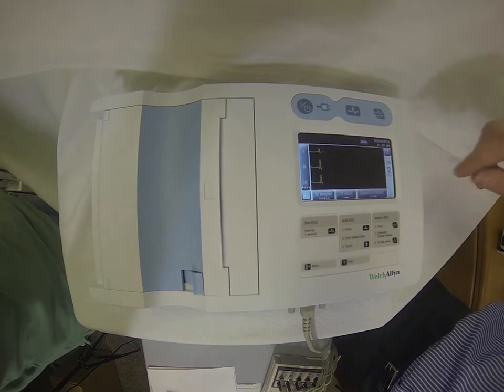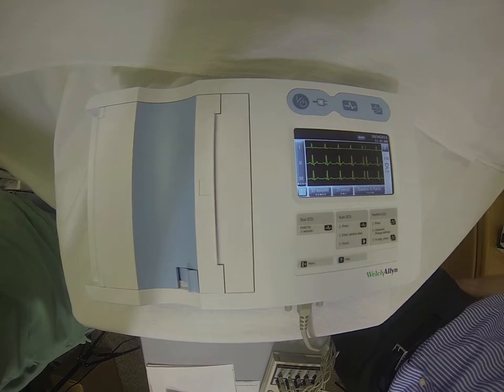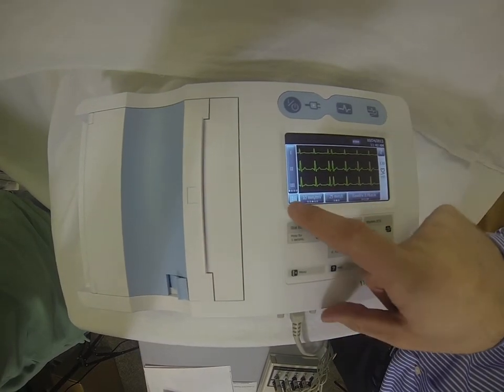Once our patient is connected, we'll use our touchscreen here. It's going to take us to our live preview screen, which is going to show us three leads at a time. If you did want to change the view, you've got the ability to do that from here.